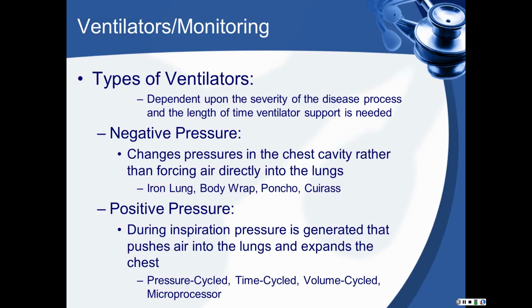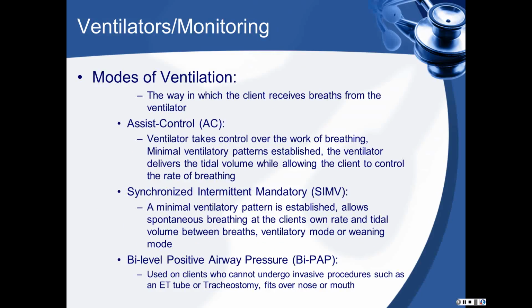And the different types of your negative pressure ventilator and your positive pressure ventilator are listed there for you on the slide. Page 677, the modes of ventilation. The mode of ventilation is the way in which your client receives their breaths from the ventilator.